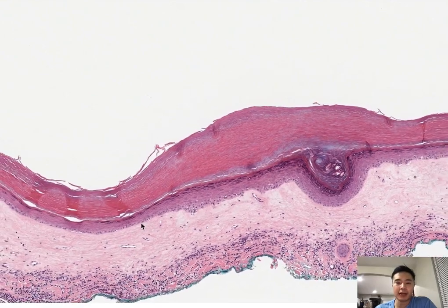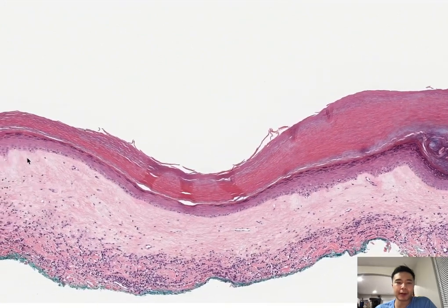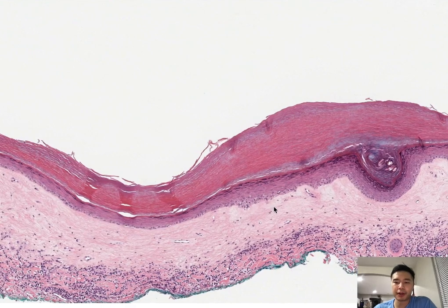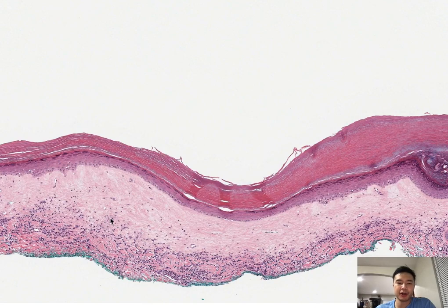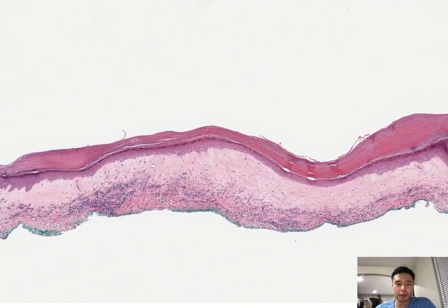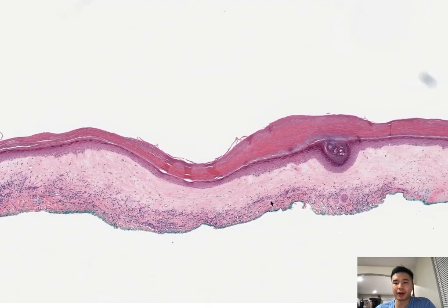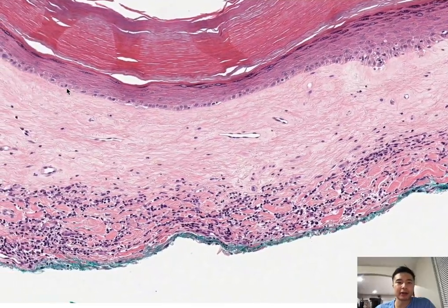And then the white is not the remaining epidermis, but the papillary dermis and the superficial reticular dermis right adjacent to the epidermis. And the buzzword is homogenization. You can appreciate how compared to the reticular dermis here, that's pink, this is white. And then lastly, as you probably correctly guessed, the blue is the lymphocytes that we see here, the driver of this inflammation, all these lymphocytes attacking the keratinocytes.